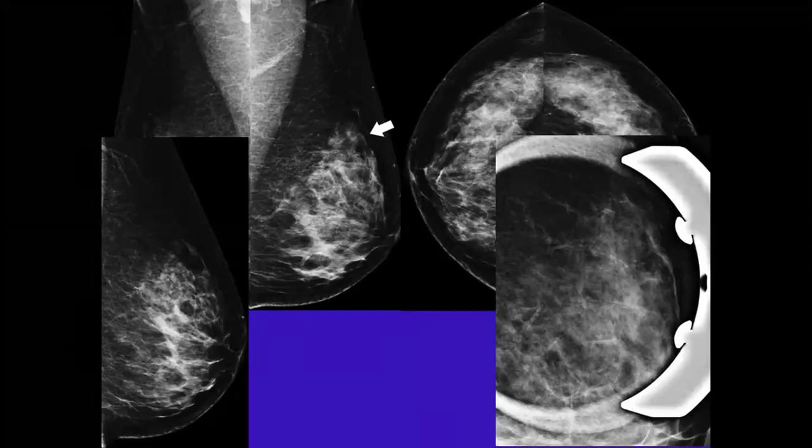It is a true lateral, straight lateral, 90-degree lateral. So is the opacity, this added density, or the asymmetry seen here? Is it visualized here? Or is it spreading or different? Is it well shown here? No, it is spreading now. It's spreading, and here on the spot magnification film, it's also spreading. Spot compression is also spreading away. So no need to repeat the CC view to make sure, or to make an extended lateral.